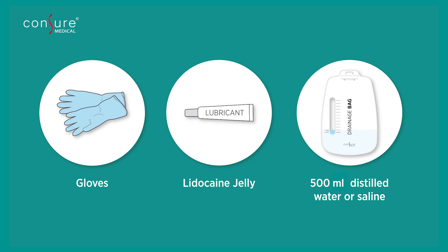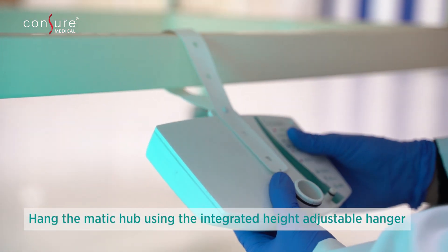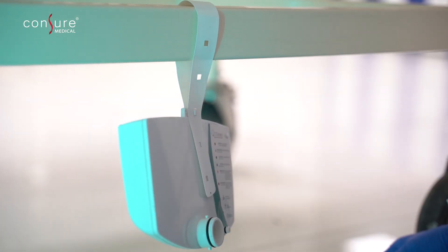In addition to the Coromatic device, gloves, lubricant, and approximately 500 milliliters of distilled water or saline will be required. To hang the Matic Hub, loop the device strap around the bedside rail and secure. Ensure that the device is upright.